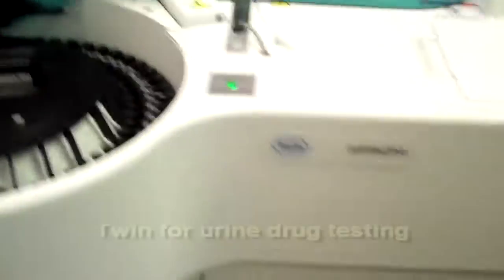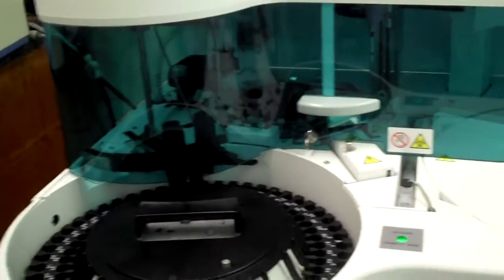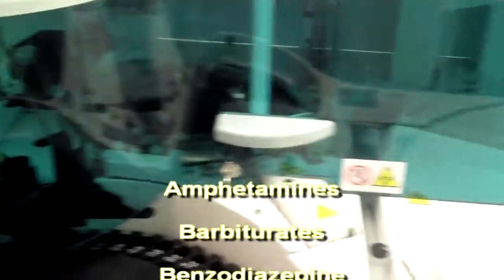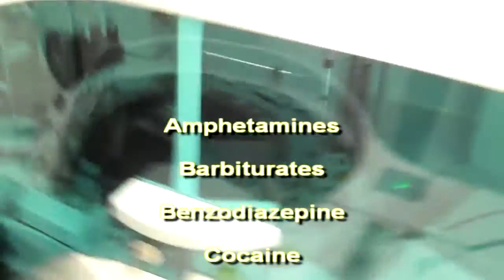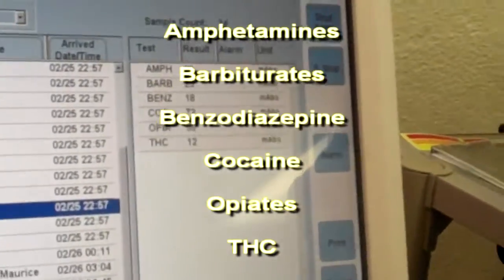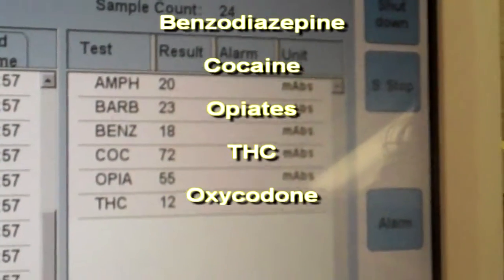So this twin is just for urine. Amphetamines, barbiturates, benzos, or benzodiazepine when it's a big long word, cocaine, opiates, THC, which is the marijuana metabolite, and that's the top 6.